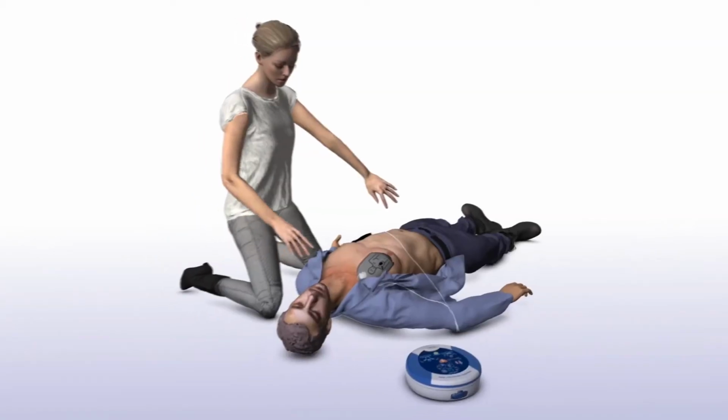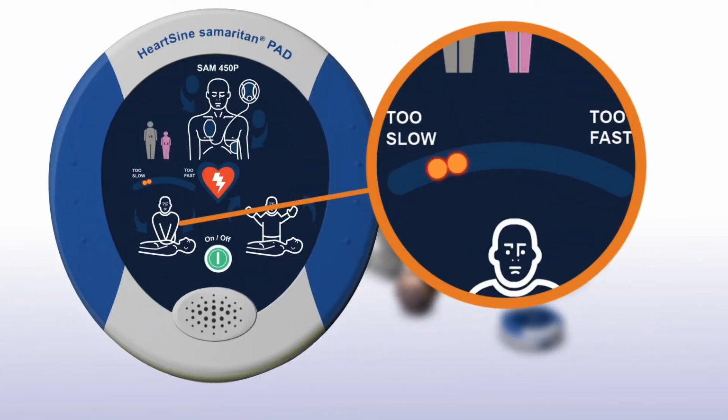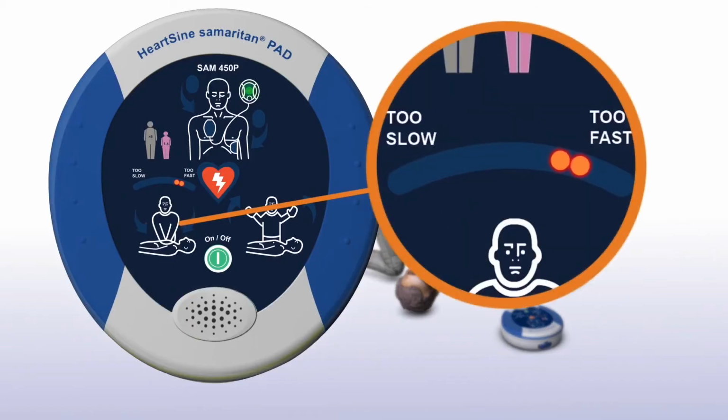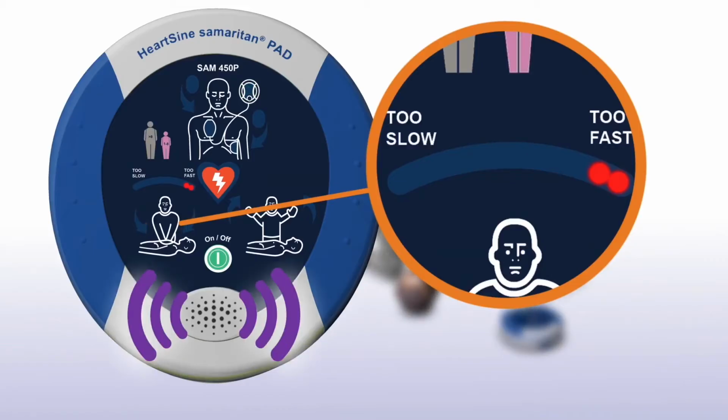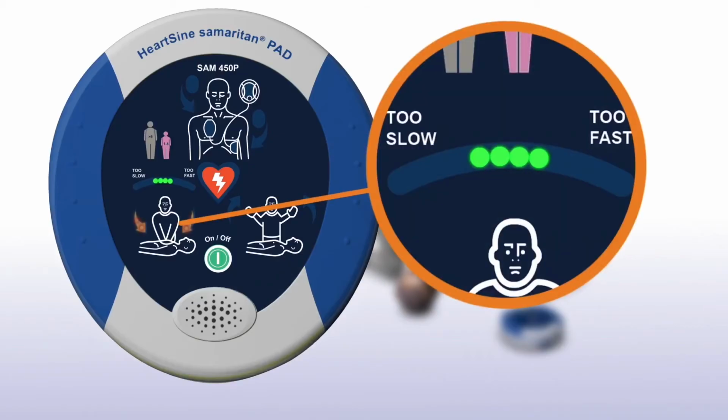Remain calm. If you are performing chest compressions at a rate that is slower than the current guidelines, the SAM 450p will prompt you to increase the rate of chest compressions. Push faster. If you are performing chest compressions at a rate that is faster than the current guidelines, the SAM 450p will prompt you to decrease the rate of chest compressions. Push slower. When your rate of chest compressions is within the range recommended by the current guidelines, the SAM 450p will reassure you that you are providing an optimal compression rate.